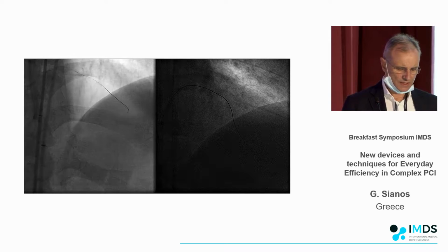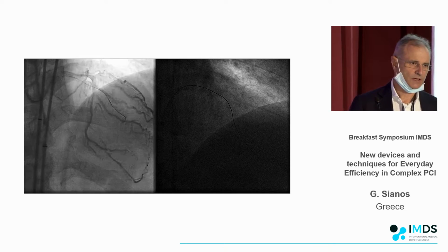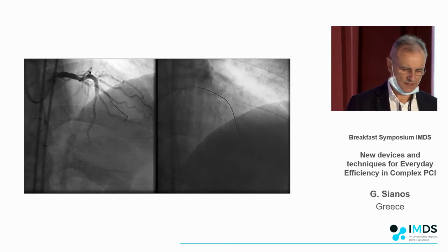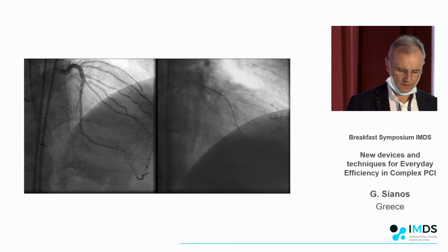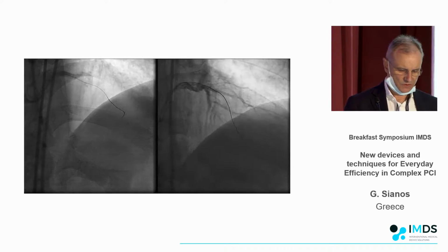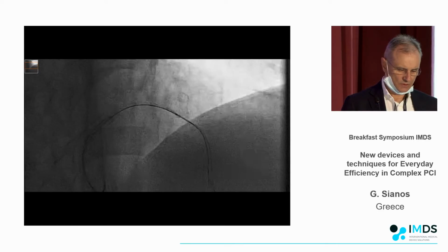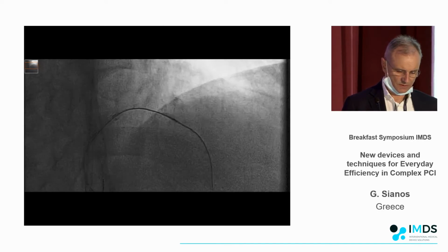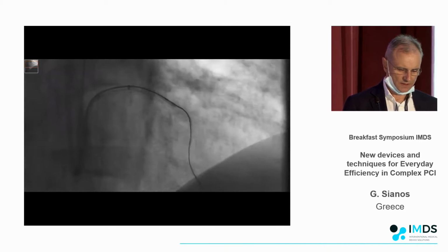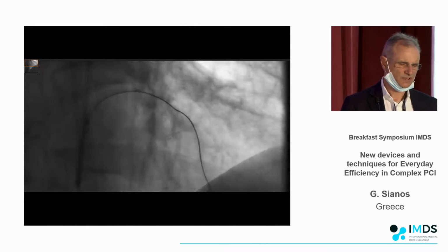I'm going to show you a case. This is a case that's not mine, so when we got experience and the people in my lab, they showed some successes. And this is a case from when I was abroad, and when I came back, he was complaining about the device. So an LAD CTO that was crossed. Our colleague tried everything. You see, he tried to put a balloon, deep engagement. He used even a guiding catheter extension. Nothing went. And then he said to me, I took a Blimp, but it doesn't work.